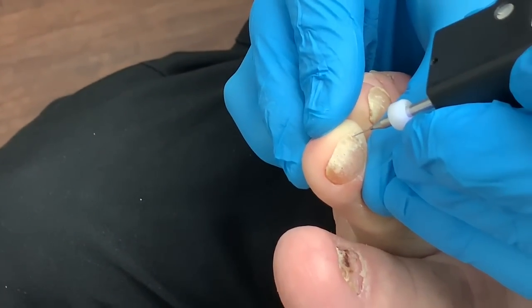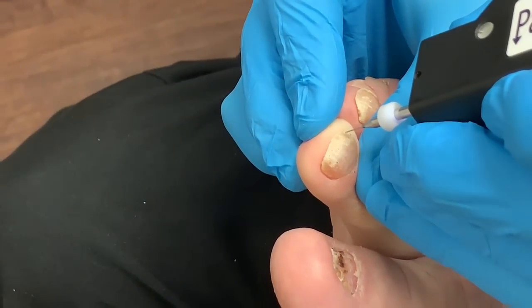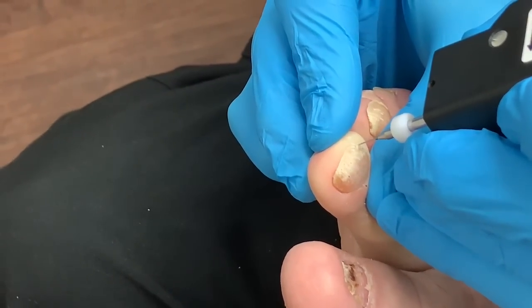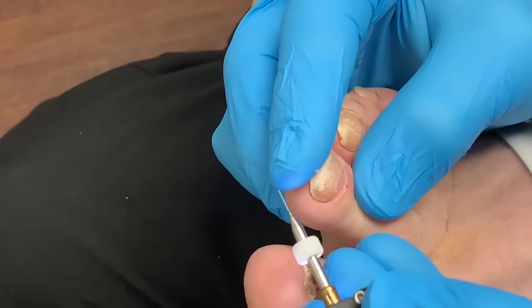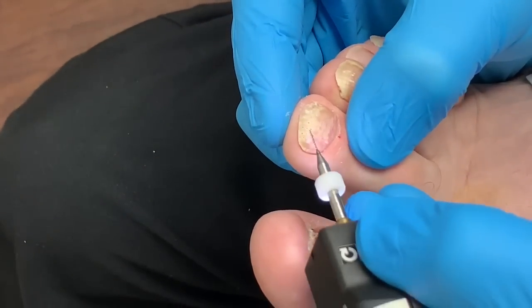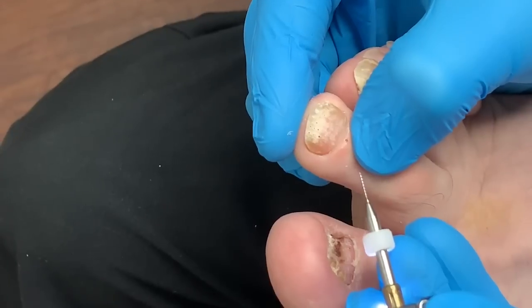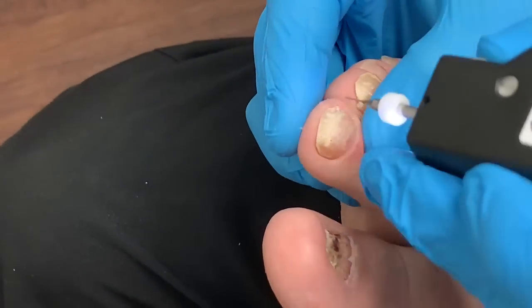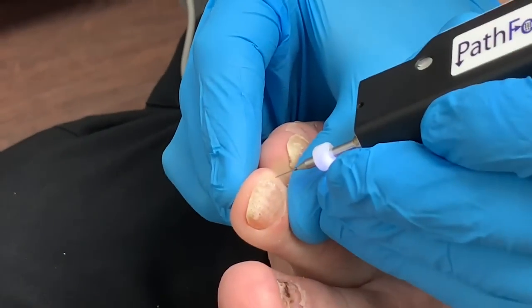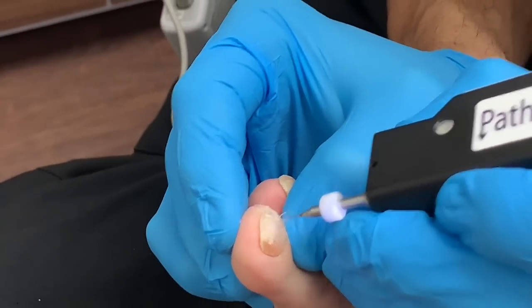In addition to that, the patient will be using a topical — we like to call it the antifungal fungal eradication kit. See, this is how sharp it is: by moving the drill from here to here, I basically came through here and you can see I scratched here a little bit by mistake — that's how sharp it is. This is super sharp, so we have to be very, very careful. That's where the technology comes in.